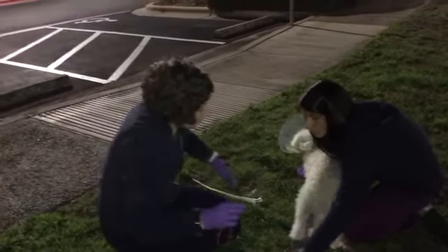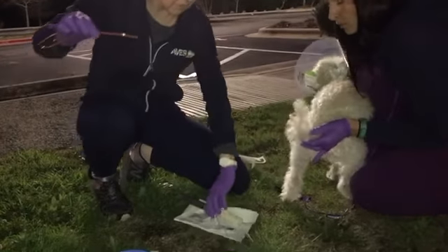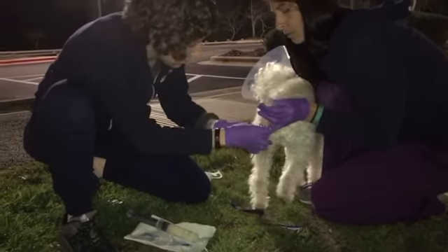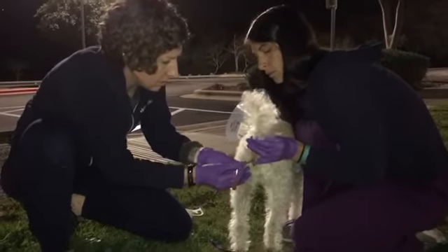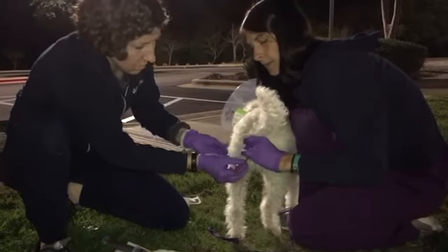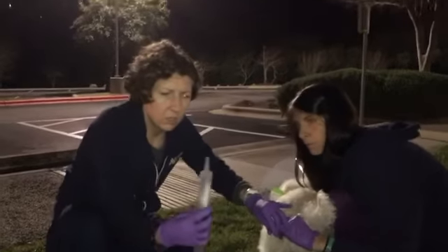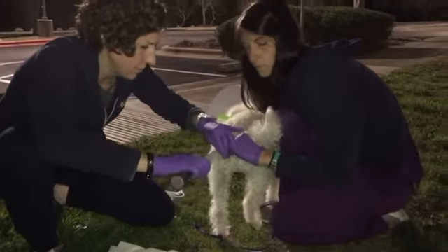Okay, so I'm going to insert this red rubber catheter, and I'm going to insert it pretty far. Wait, Bubba, hold on. That's good. A little further. Okay, so she's going to kind of pinch the rectum, and now I'm going to get the air out of the tip of this. There we go. And just nice and steady.